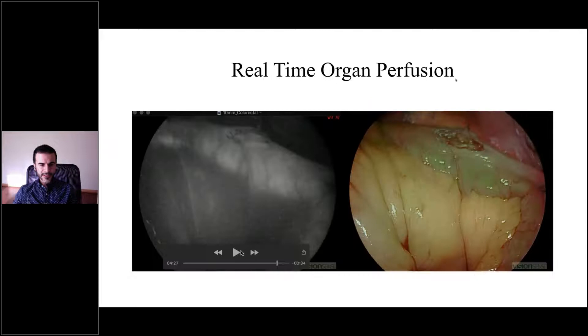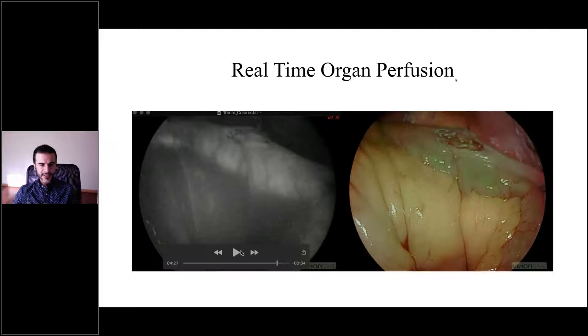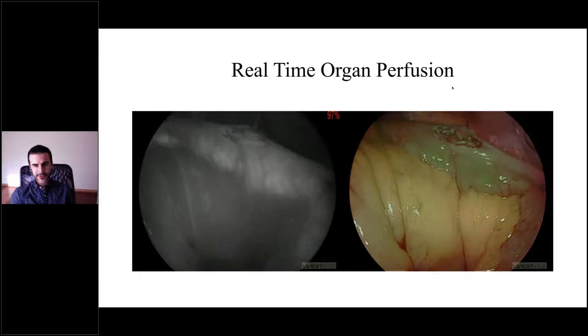This is another example showing a jejuno-jejunostomy where the jejunum looks well perfused.